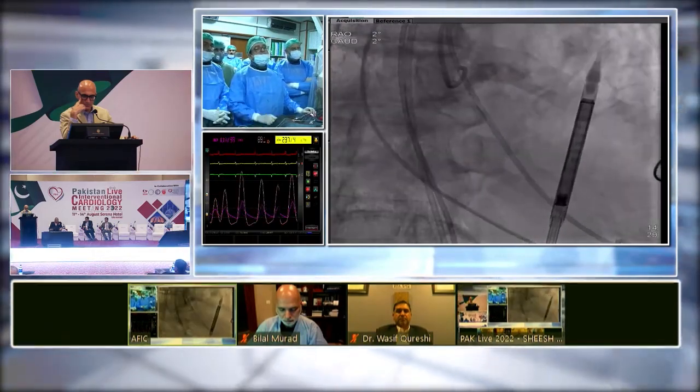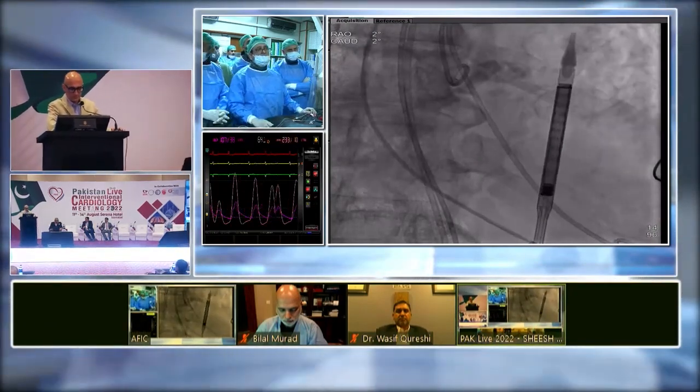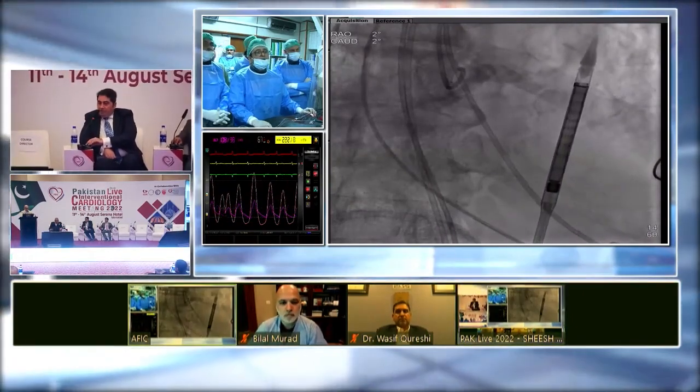Do you always use the, sorry, it's Ali Raza here. Do you always use the pacing wire? Because I tend to mostly prefer over the wire pacing, but is it just because it's a live case, or do you?